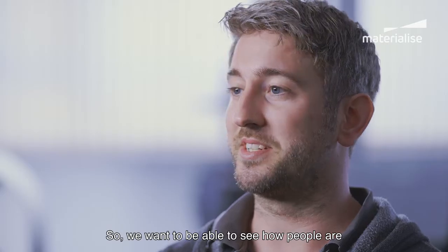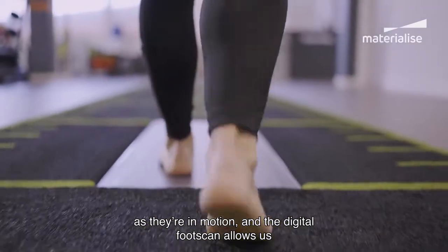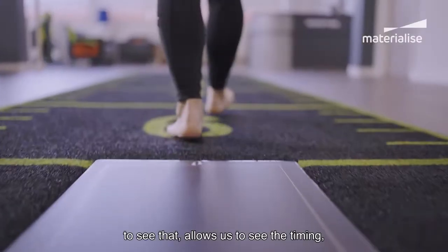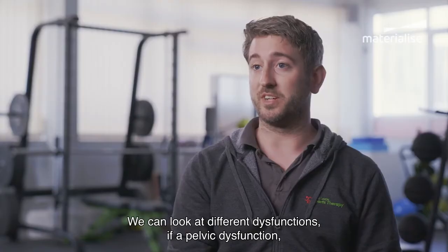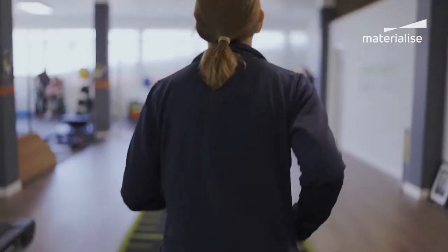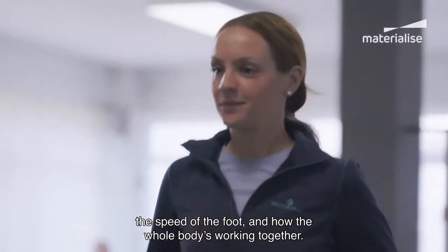We want to be able to see how people are as they're in motion, and a digital foot scan allows us to see that. It allows us to see the timing, how the patient's moving, the symmetry between their two feet. We can look at different dysfunctions, such as pelvic dysfunction, the speed of the foot, and how the whole body's working together.